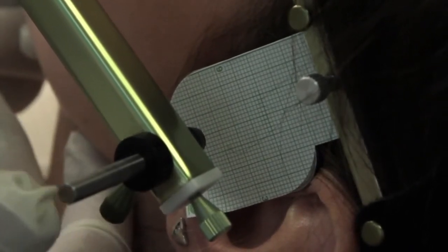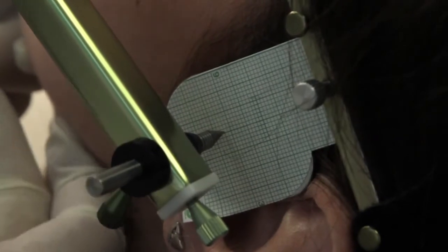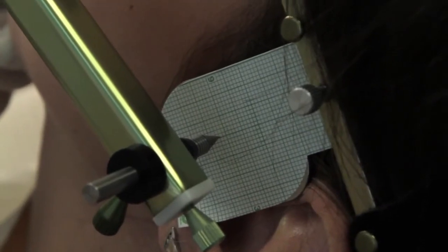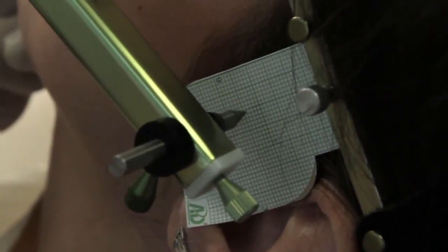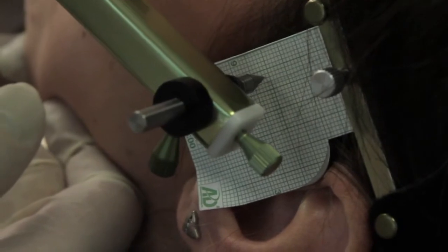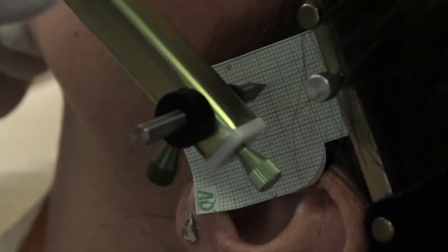Again, finger on the gonial angle, touch the pen against the flag, let go. Now open, please. Close. Now it made the same arc, only much, much smaller. Now I'm going to go way above it. Okay, now open, please. Close. Now it made an arc like this.